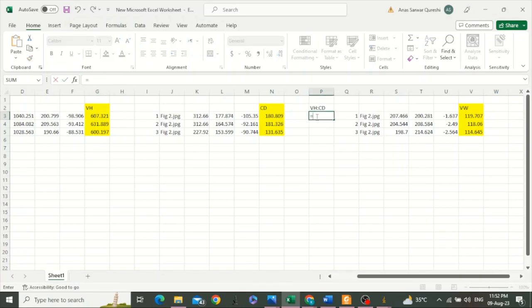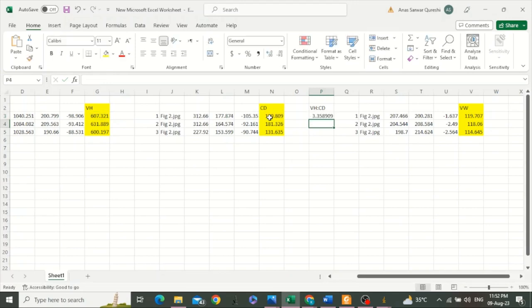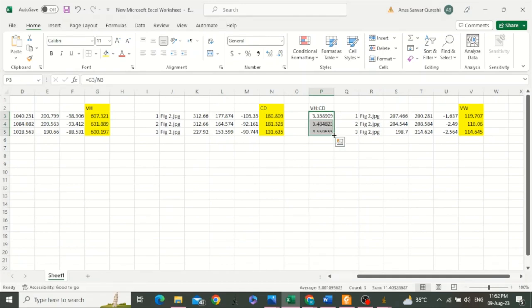For that, we will type equals, this divided by this, and press Enter. And drop this cell for the calculation of all the values.